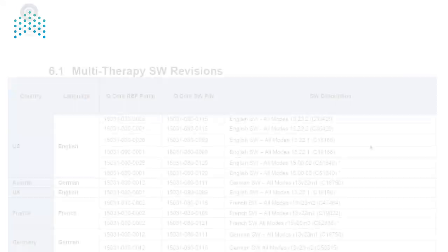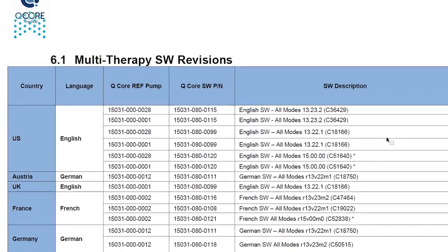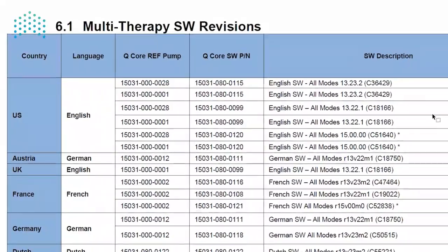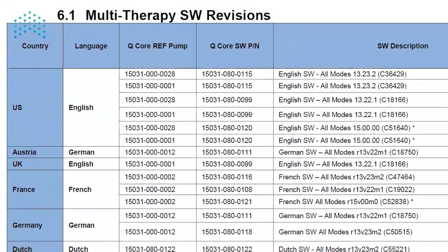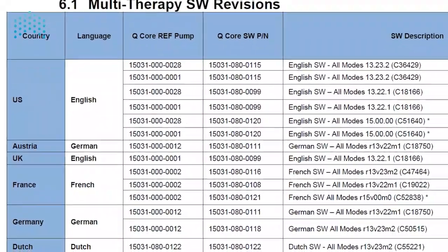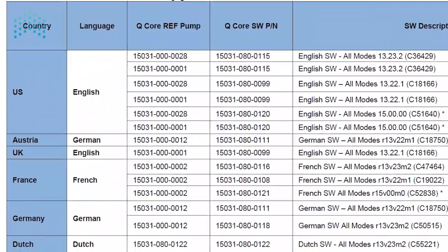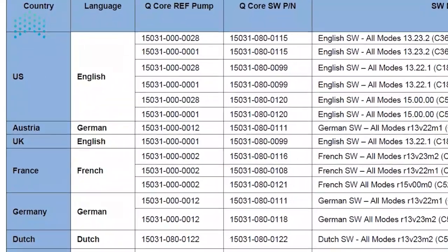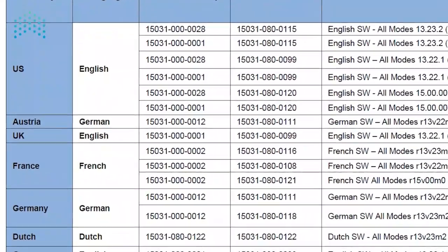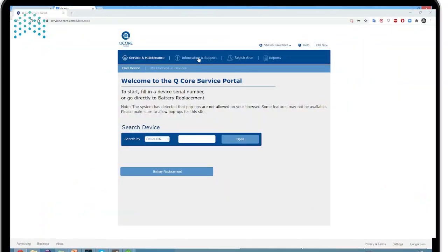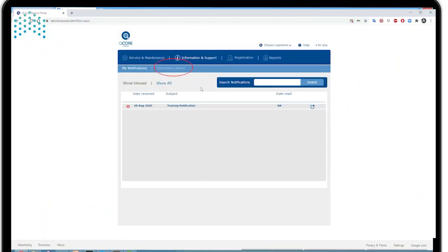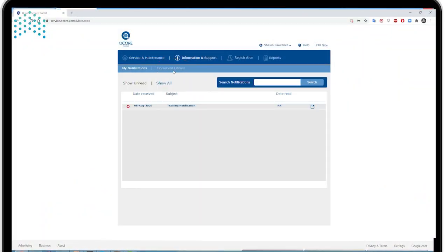Before we can proceed, we need to verify which software revision can be installed on the pump by referencing the labeling and SW revisions table for QCore service providers. This document can be found in your document library in the service portal.